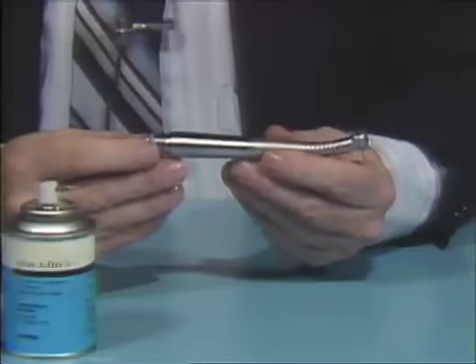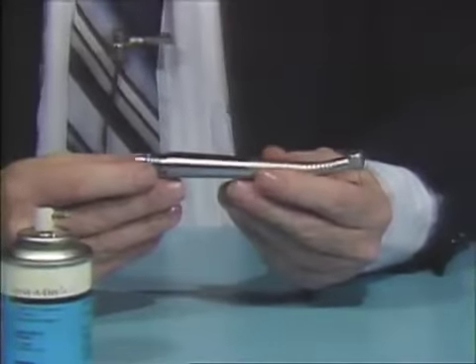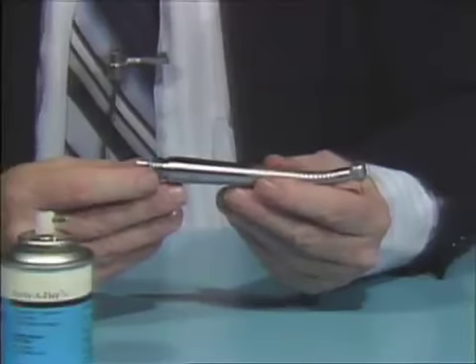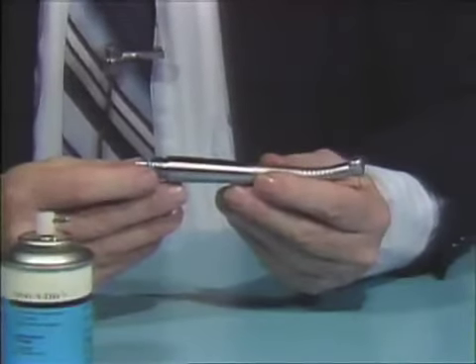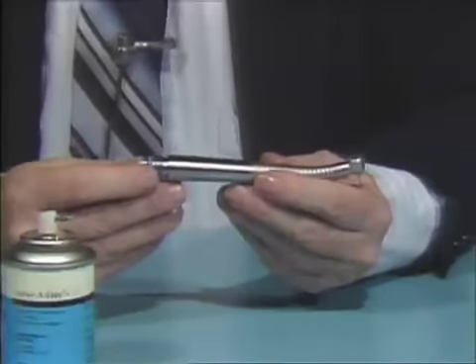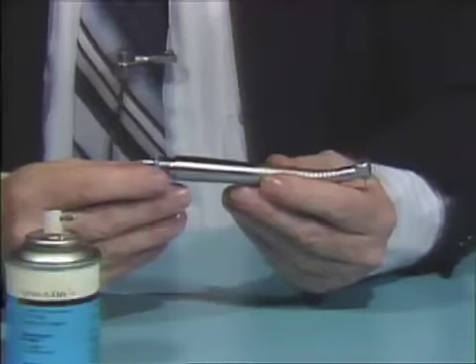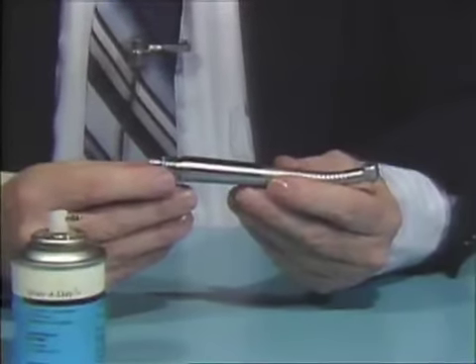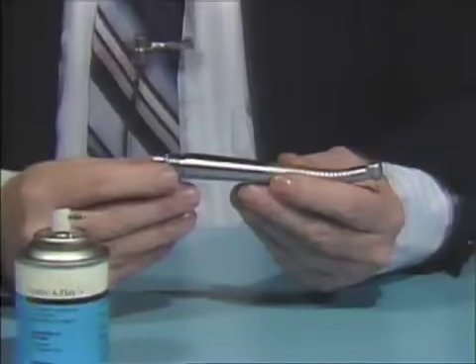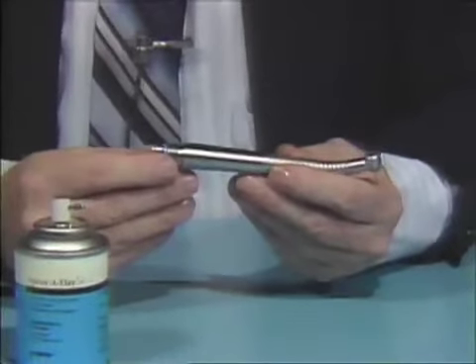If the handpiece is used even once a day, you should apply the Spray-A-Day to it. When sterilizing the handpiece, you should lubricate and run it before sterilization, then sterilize it, then lubricate and run the handpiece again after sterilization.